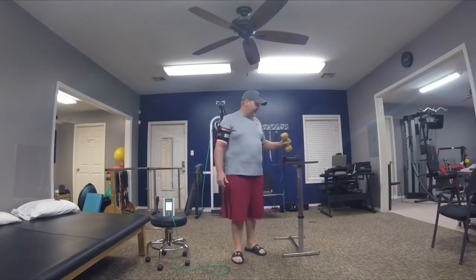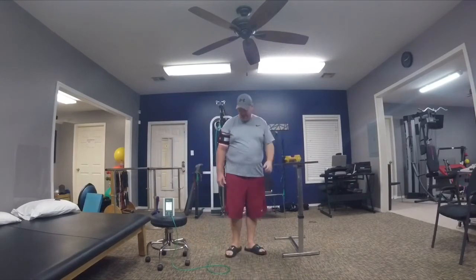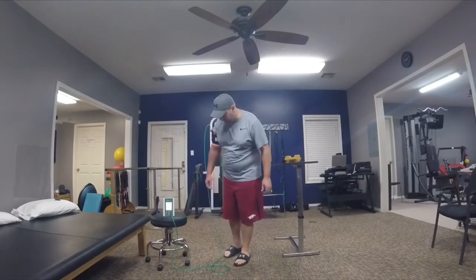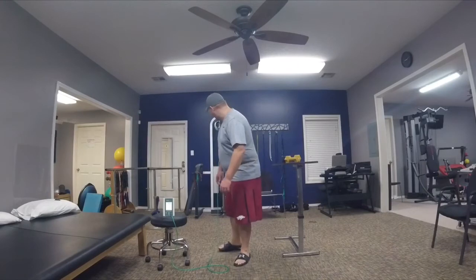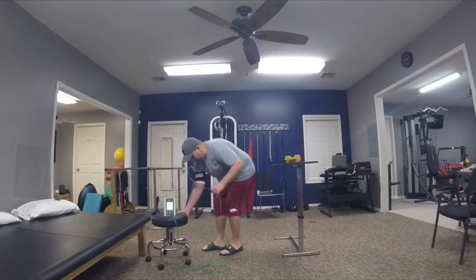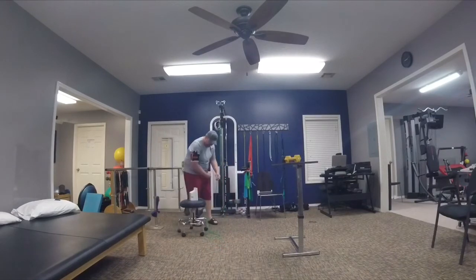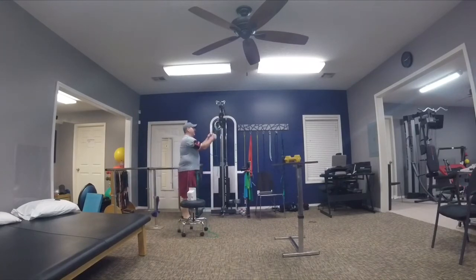I got to about 7 with the 8 pounds, and I could not finish. I probably could have had a lesser one, like maybe a 3 or 4, and I probably could have finished with that, maybe. So now I'm going to bring this back here, where I'm going to try some tricep pull downs with just green TheraBand. Nothing too strenuous with the green TheraBand. So here we go. 1. We're doing 30 again.